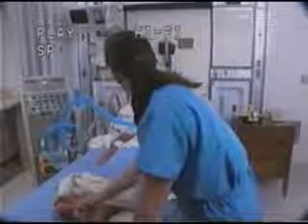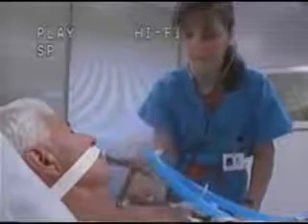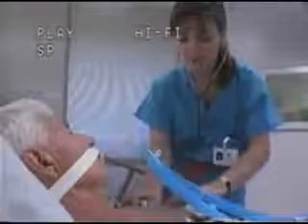Do you have good sensation down here? You can feel my hands? Great. Patients on mechanical ventilation must have their breath sounds auscultated frequently. The nurse auscultates Mr. Kirkpatrick's lungs anteriorly, laterally, and posteriorly, comparing breath sounds from side to side for adventitious sounds, crackles, wheezes, or rhonchi. If the breath sounds are decreased or absent on the left side, the nurse is concerned that the ET tube may have moved into the right mainstem bronchus, or that he has developed a pneumothorax.